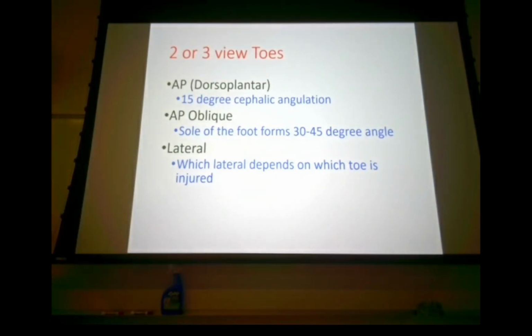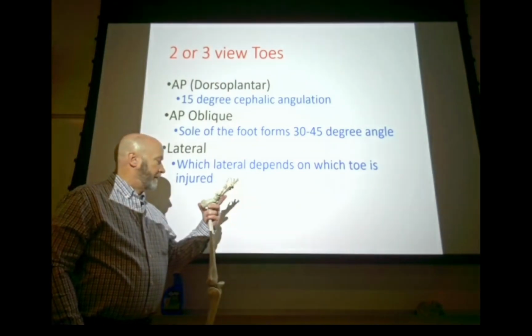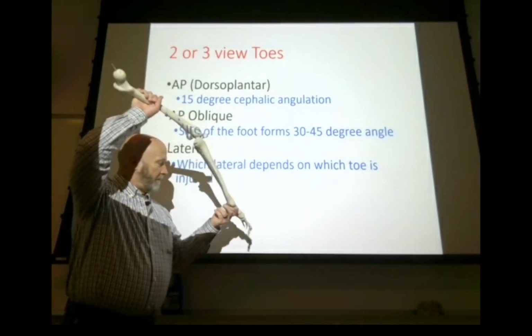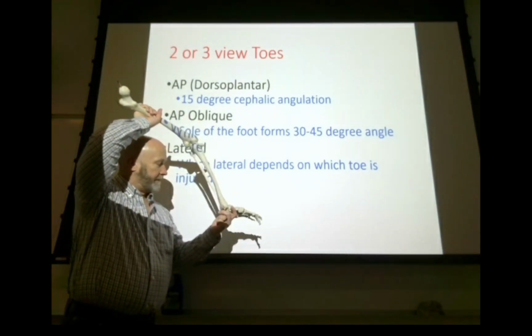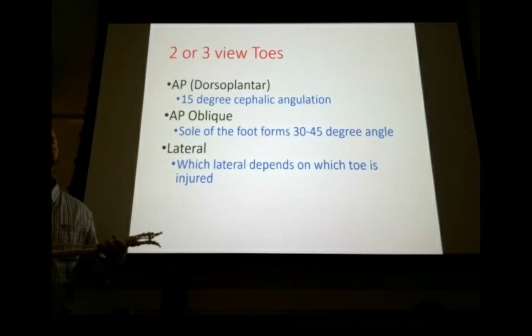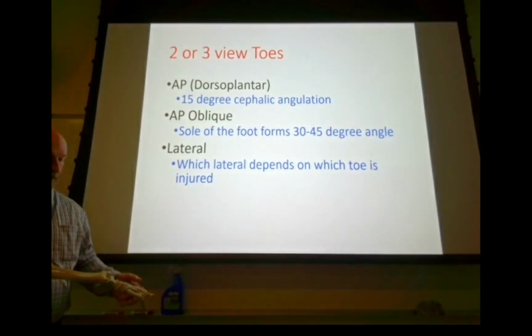Okay? And because of all of the superimposition that you get in feet and toes, with all those bones put on top of each other, the lateral, it's difficult to get a diagnosis off of a lateral, and we're going to take a look at that here in a little bit.